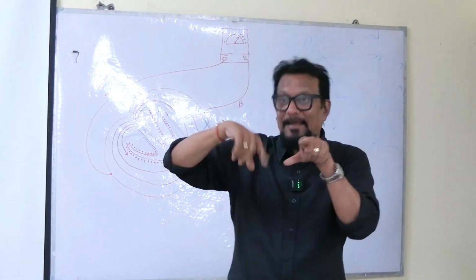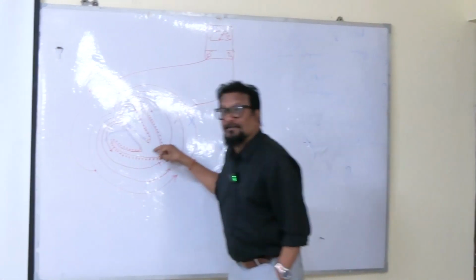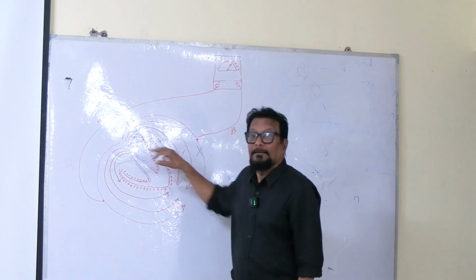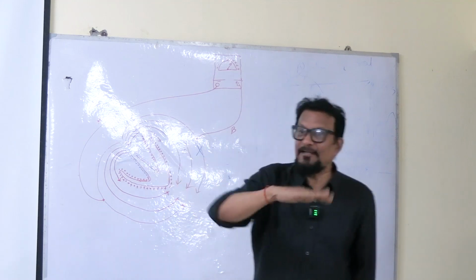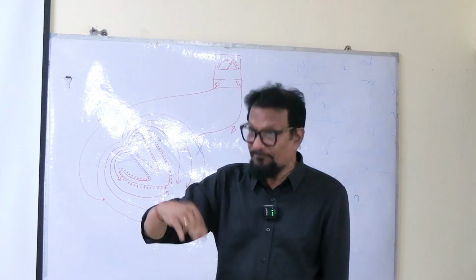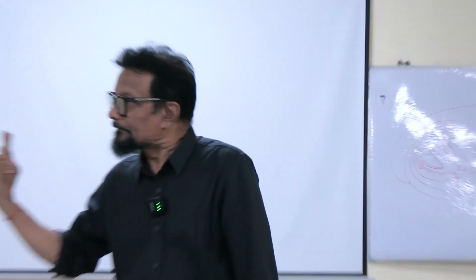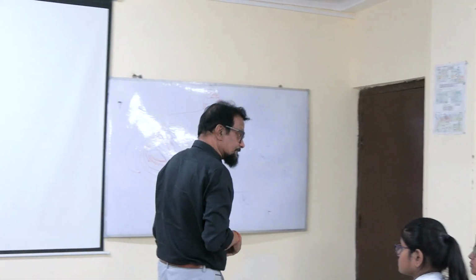So on a paper you will get this potential difference, and we know this condition is not fixed. This will travel again this way, again this way. Now the voltage will be different and this will be changing. So this deflection is always changing. And if we record this changing deflection on a paper, you will find different waves. And these are ECG waves. Is that okay? Could you follow? So in this way you can record ECG waves.